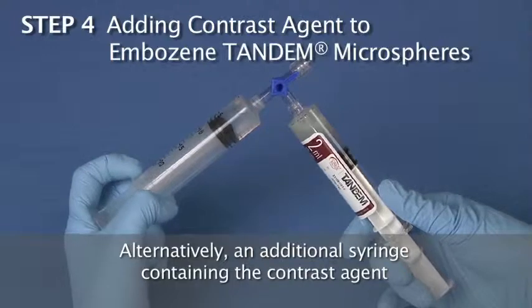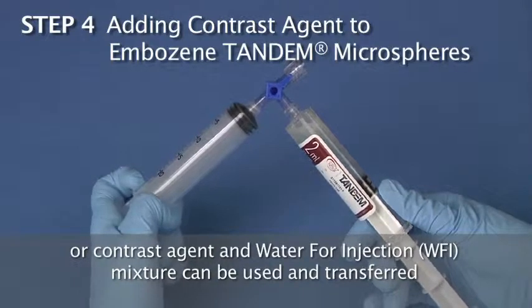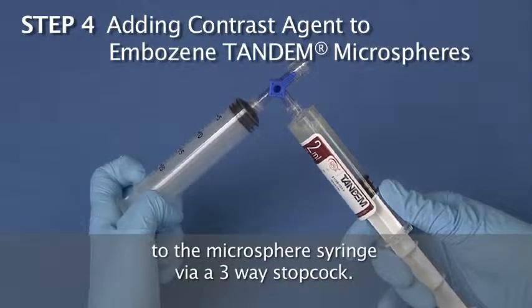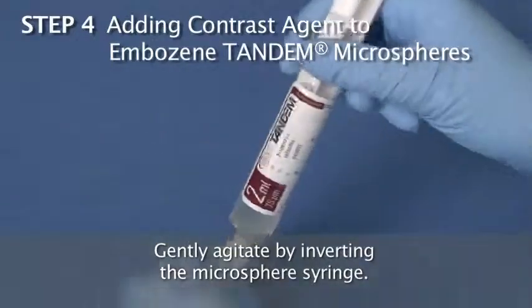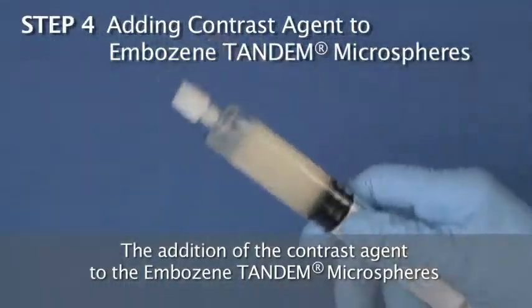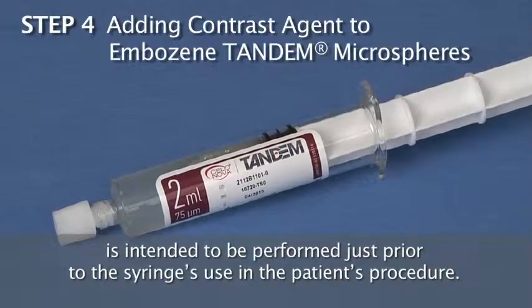Alternatively, an additional syringe containing the contrast agent or contrast agent and water for injection mixture can be used and transferred to the microsphere syringe via a 3-way stopcock. Gently agitate by inverting the microsphere syringe. The addition of the contrast agent to the tandem microsphere syringe is intended to be performed just prior to the syringe's use in the patient's procedure.